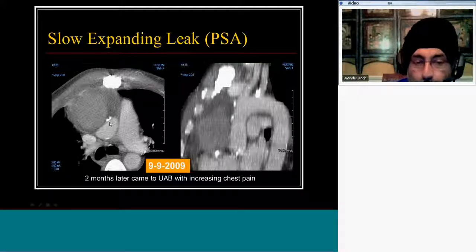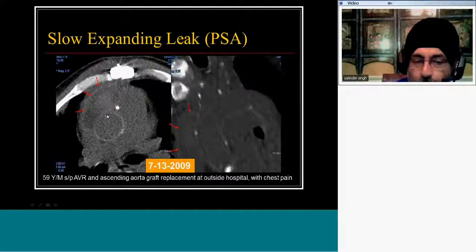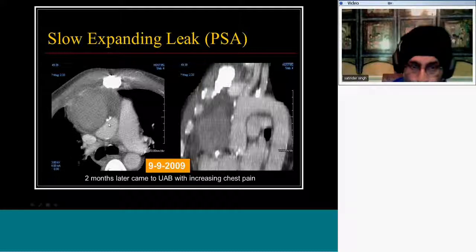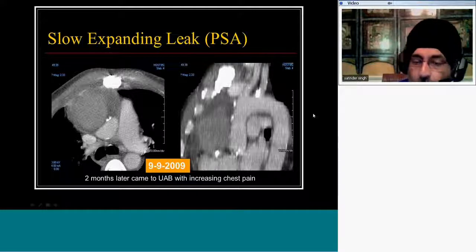It's deforming the anterolateral wall of the aorta compared with the previous study here, and correlated with the coronal imaging. At this time, contrast was given, and you can see there is a slight increased density. So we are not sure whether contrast is actually leaking out or this is just a hyperdense hematoma. Even at this stage, nothing was done because these patients are high-risk patients. Nobody wants to touch them because they carry a lot of mortality with the operation.